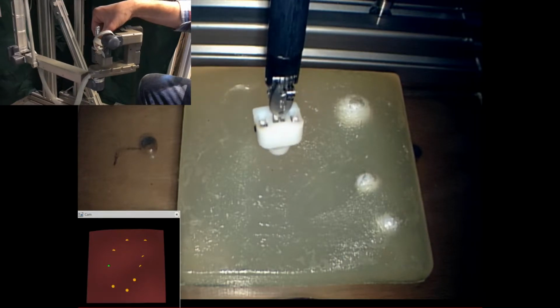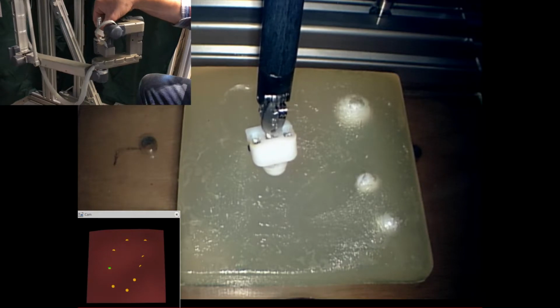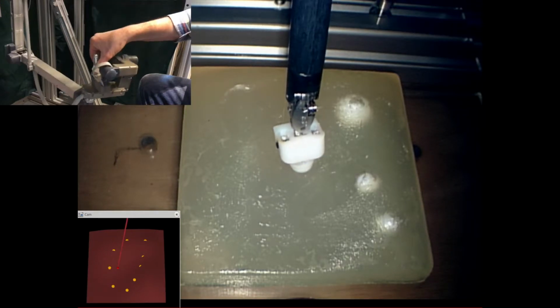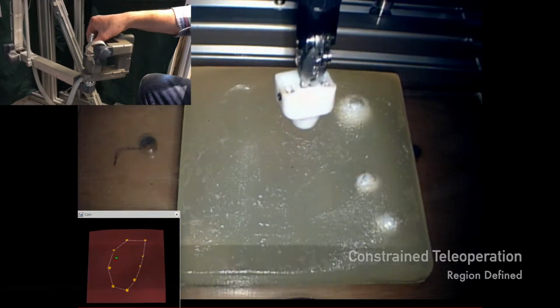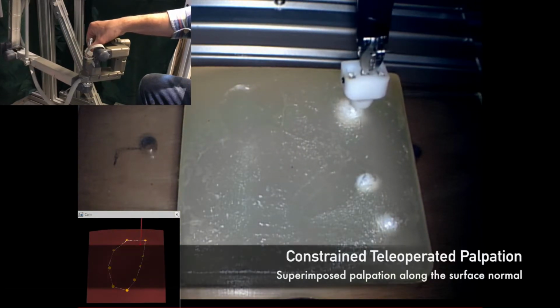The user selects points with a gripper to designate the boundary of a virtual fixture that constrains lateral motion to be within that space. When the virtual fixture is enabled, the robot can move freely above the organ, but no movement is allowed that would push the slave robot out of the boundary.